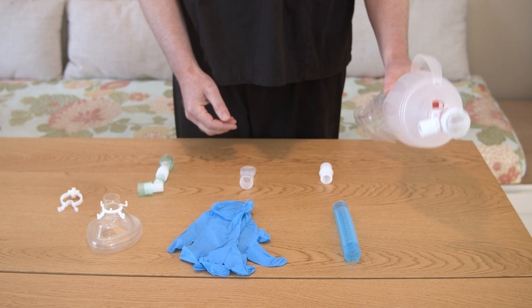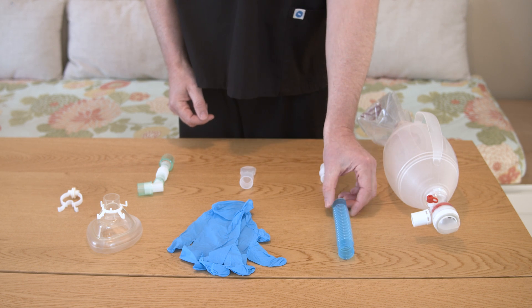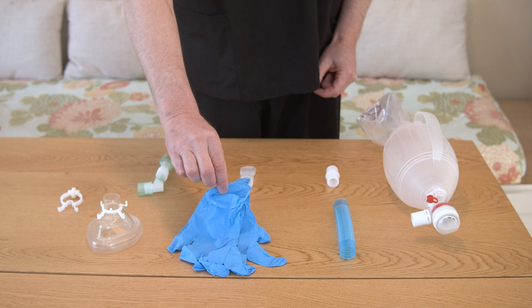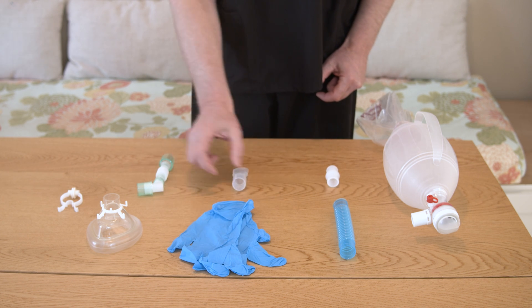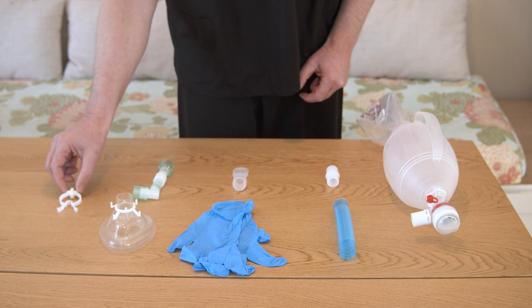You will need: a manual resuscitation bag; a piece of extension tubing, if needed; an adapter, if needed; non-sterile gloves, if you want to wear gloves; a patient interface such as a mouthpiece, face mask, or a trach tube adapter; and a nose clip, if needed.